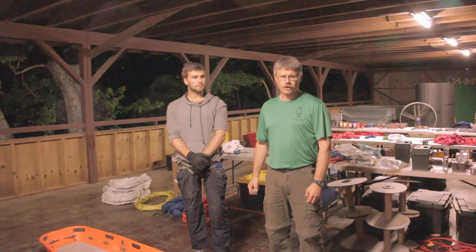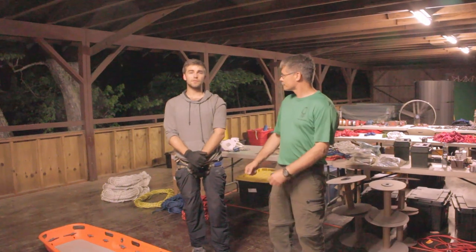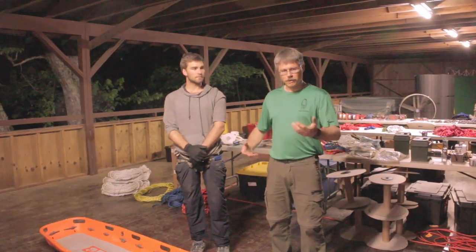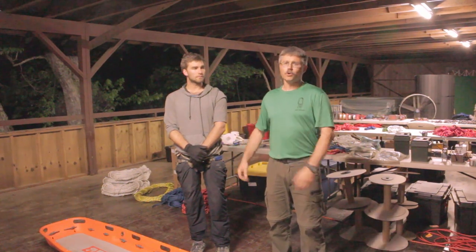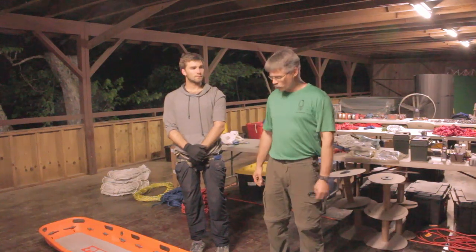Hi, I'm John Punches, the training coordinator for the National Cave Rescue Commissioner, NCRC. My name is Eric Cullen; I'm a student during the NCRC Regional. We're here at the Mentone Seminar in Mentone, Alabama, 2018, and we're going to show you a brief overview of how we do our packaging technique in the Ferno Model 71 litter.